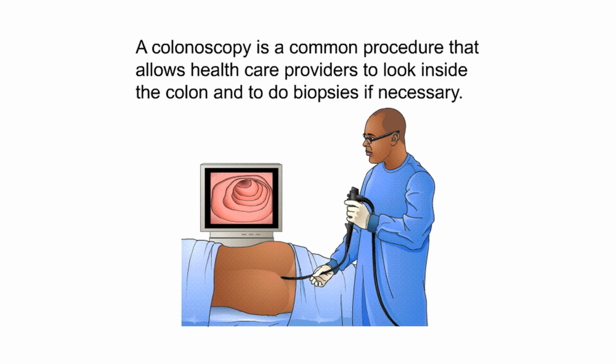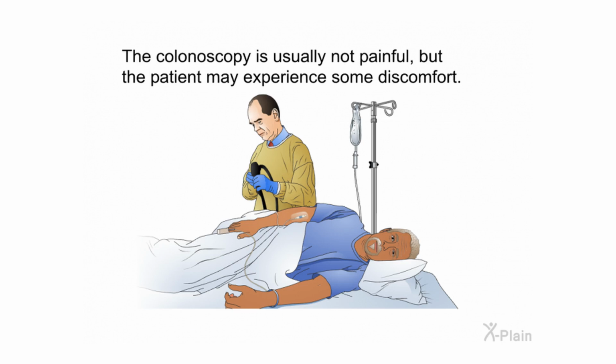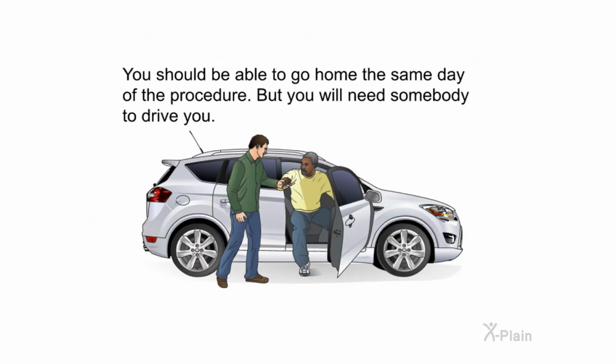Summary. A colonoscopy is a common procedure that allows healthcare providers to look inside the colon and to do biopsies if necessary. The colonoscopy is usually not painful, but the patient may experience some discomfort. You should be able to go home the same day of the procedure, but you will need somebody to drive you.